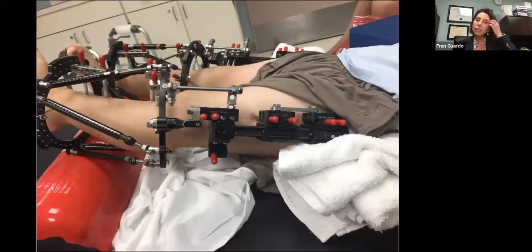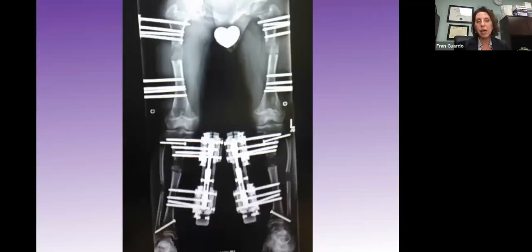This is a 4-segment lengthening with an external fixator, and this actually has, the top has a, I can't find my cursor. The top has a modular rail system and the bottom has a Taylor spatial frame. This is a bit of an older picture. Nowadays it would be a Vilex and a drive rail. And this is an X-ray of external fixation.